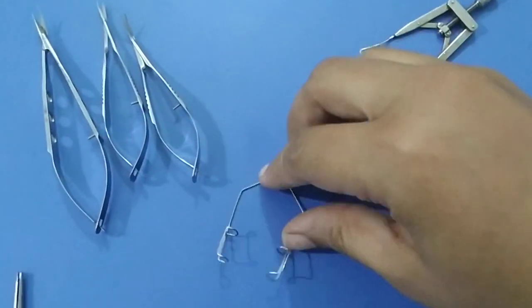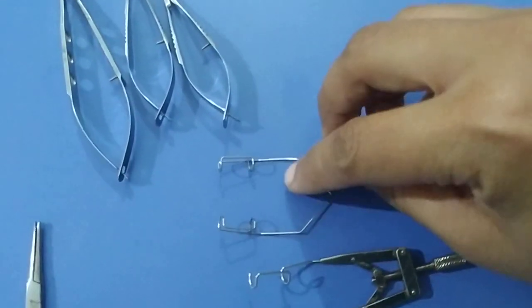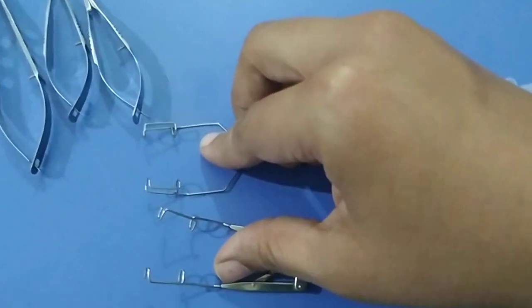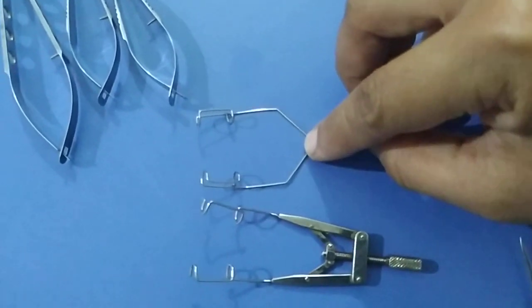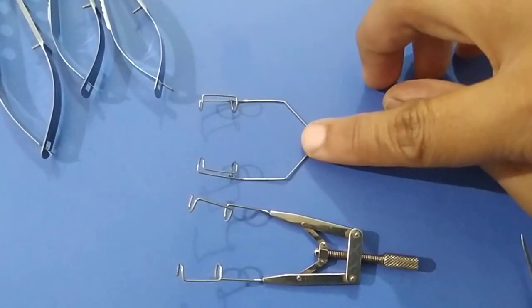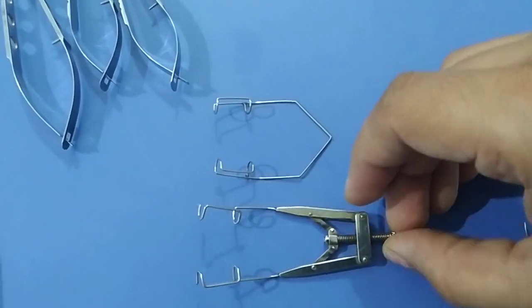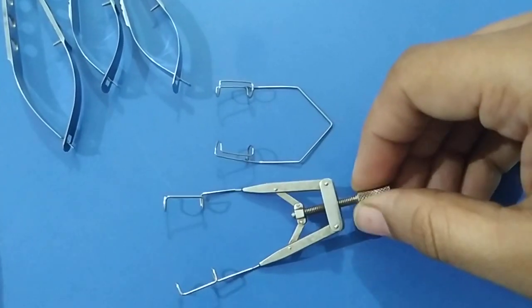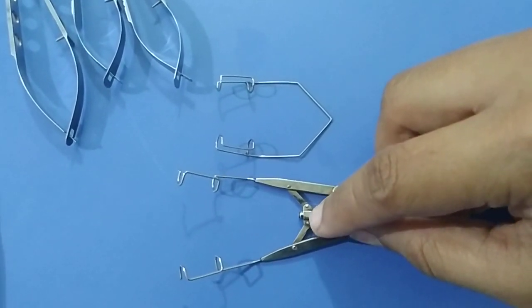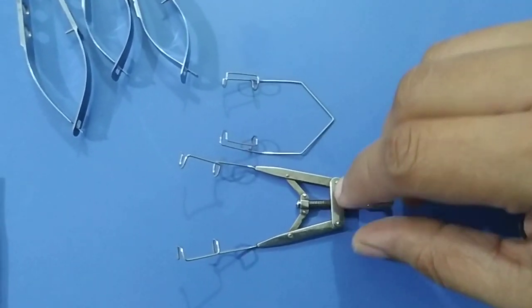We will start with the wire speculum. This is a wire speculum and this is a universal wire speculum with cord. The use of wire speculum is to keep lids apart during any type of cataract surgery. But this is used for small incision or extracapsular cataract surgery, pterygium surgery, and keratoplasty surgery, because this gives less pressure on the globe. The universal speculum gives more exposure and can be used in retinal detachment surgery, squint surgery, and extraocular surgery.